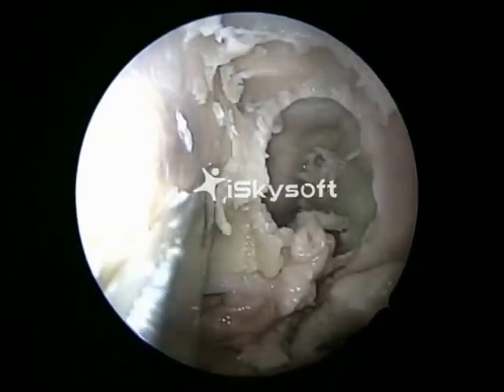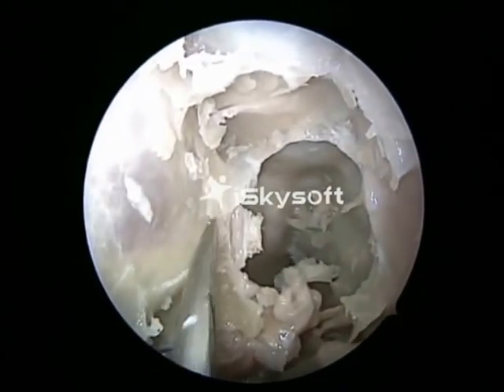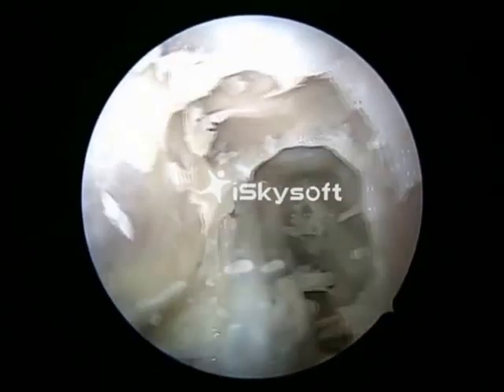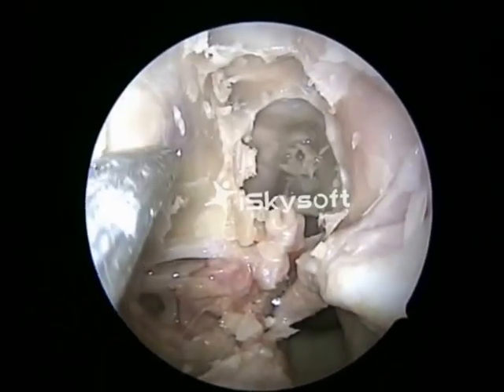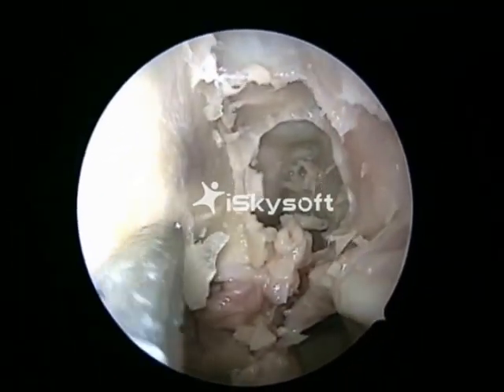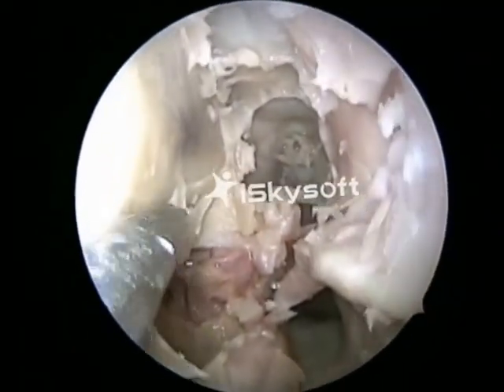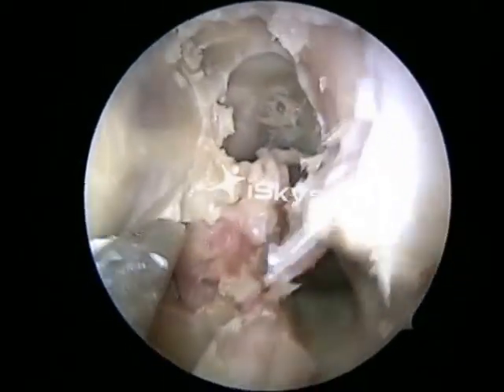We can see the medial rectus muscle there. As we go posteriorly, the medial rectus muscle is very close to the lamina papyracea, and as we come anteriorly, the medial rectus is hidden by fat. We can now see that we are going inferiorly towards the infraorbital nerve.